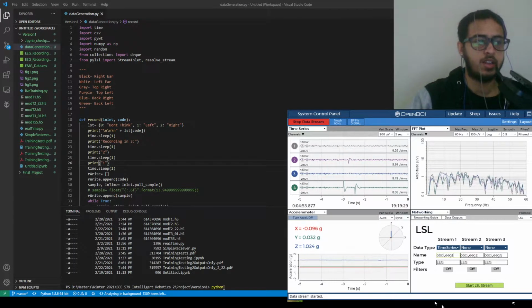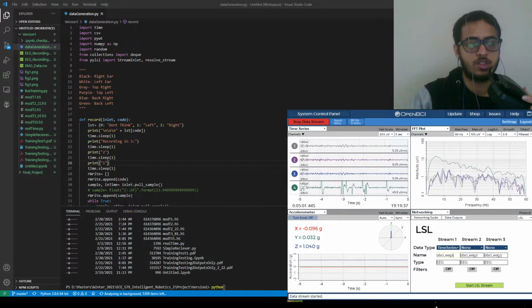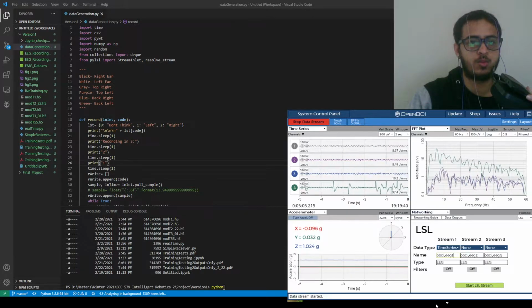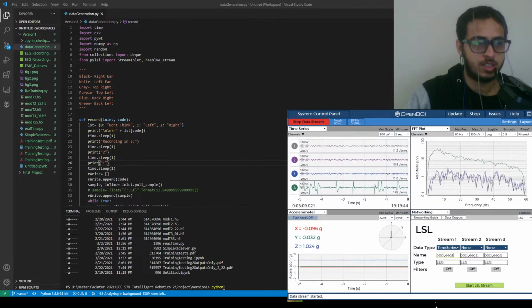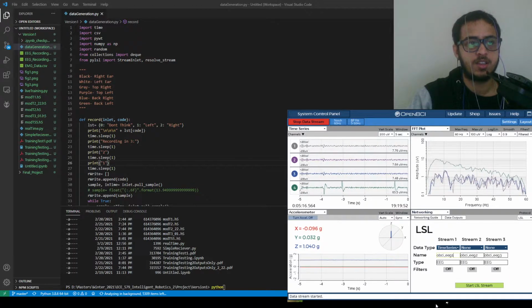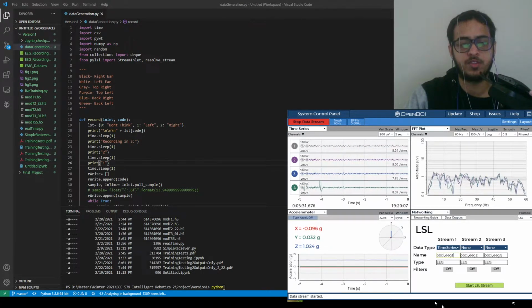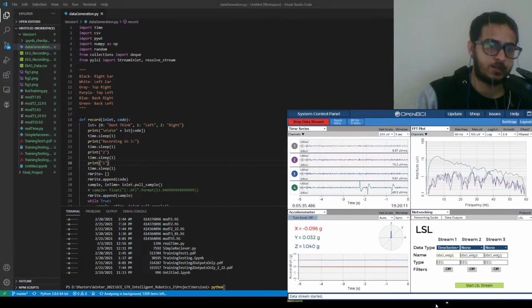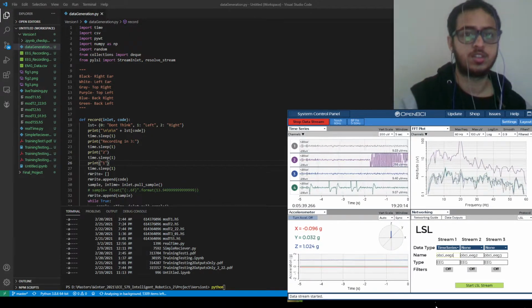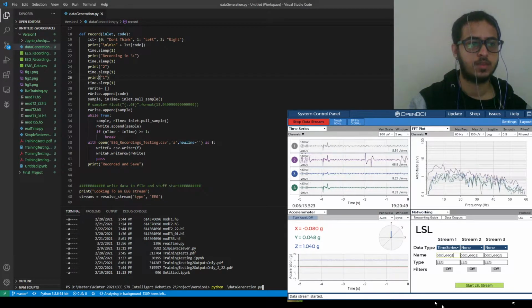I'll probably skip some of the recording. I'll show you one or two recordings because the recording process is quite long, and to take one signal recording it takes about 10 to 12 seconds. Usually one recording session lasts for about 10 minutes or something. So for now, I'll just record around 60 to 100 recordings, and I'll show you one or two of them. And once I'm done recording all of them, I'll show you the process of training and testing. So now I'll start the recording.